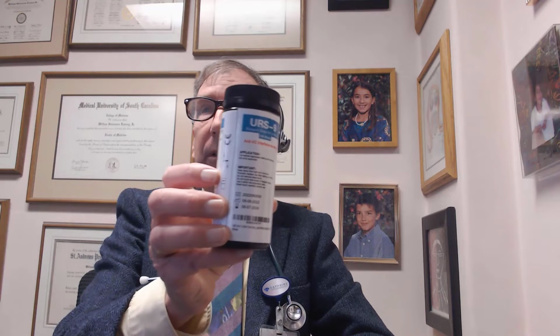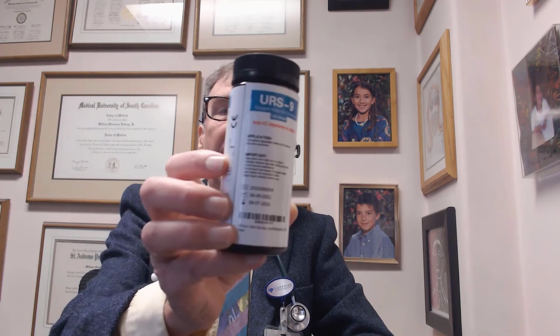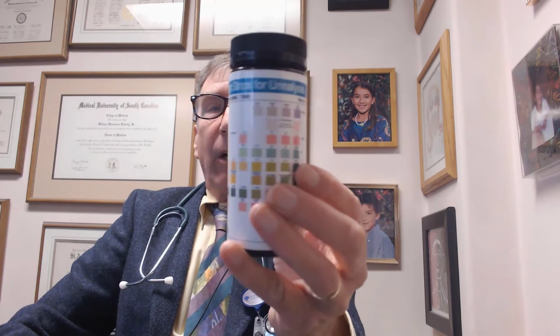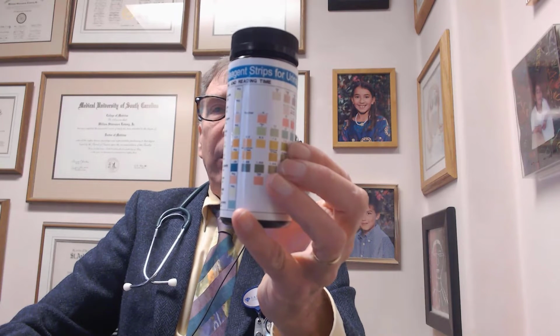So it helps to have some way to diagnose this at home, and I picked up these strips. They're called URS-9. URS-10 includes glucose, but there's dozens of these online. And as you see on the back, they have a little graph that you compare them to. Now, this is very easy to do at home, and then upload to your doctor, show them a picture or describe what you find.